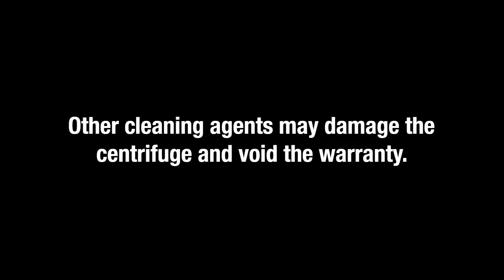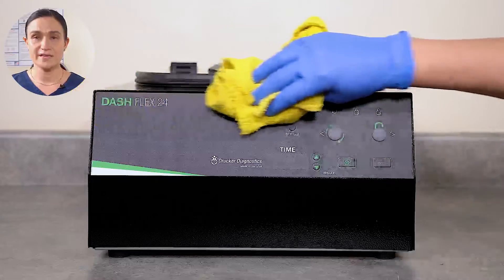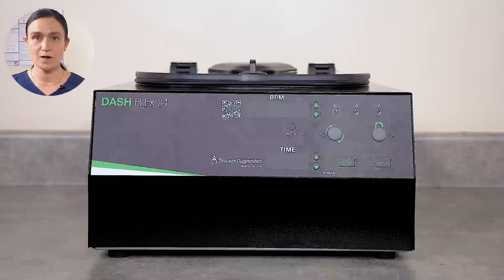Any other substance is not approved and may cause damage to your centrifuge or void the warranty. Apply your isopropyl alcohol or 10% bleach solution with a cloth. Do not submerge the centrifuge in water.